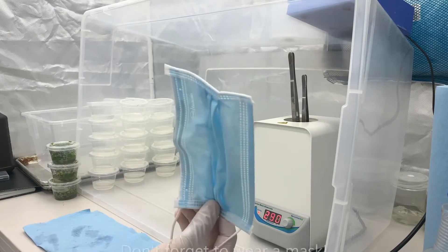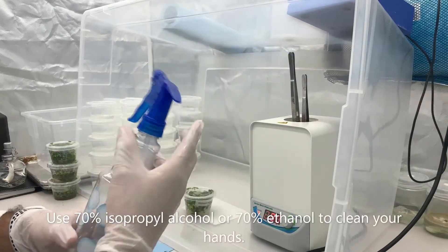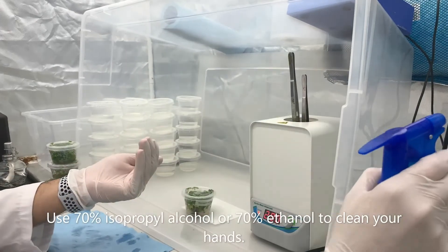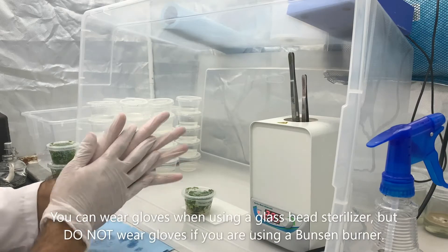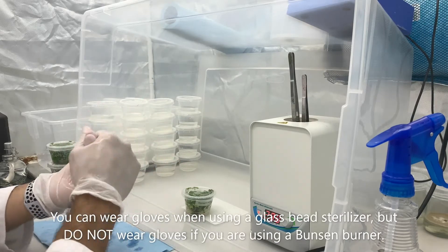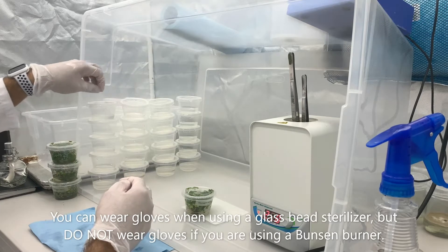Always remember to wear a mask. Use 70% isopropyl alcohol or 70% ethanol to clean your hands. You can always wear gloves when using a glass bead sterilizer, but I would not recommend wearing gloves if you're going to use a Bunsen burner to sterilize.